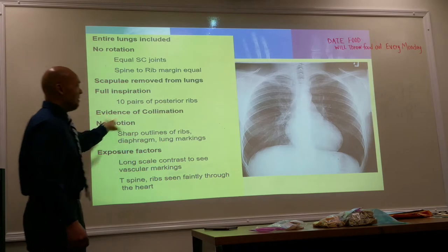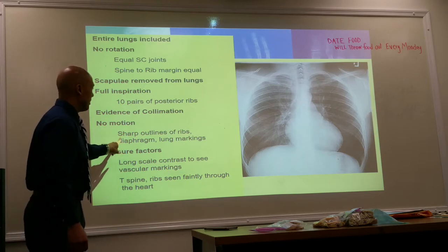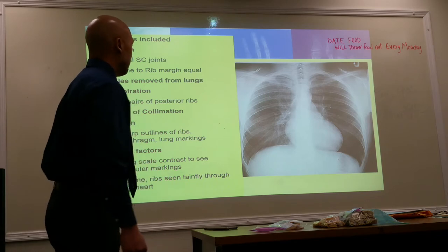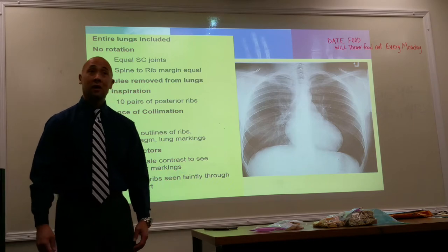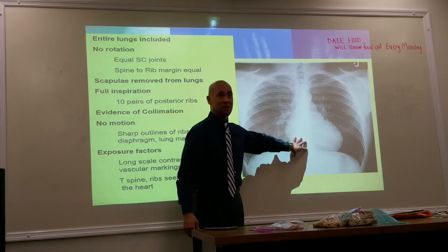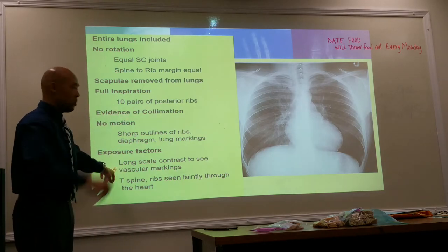All right. Evidence of collimation is demonstrated. We've got our left marker. Left marker is good, right? No motion. Sharp outlines of rib markings and diaphragms and lung markings are demonstrated. Time. Do we need long time or short time? Short time. So holding the breath will minimize any movement, but one thing that we can't control is heart motion. So that's another thing you want to take into consideration, a quick exposure time. All right, so long scale contrast, that means more grays.